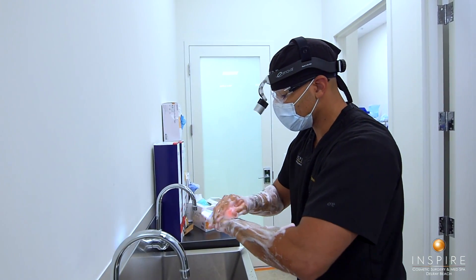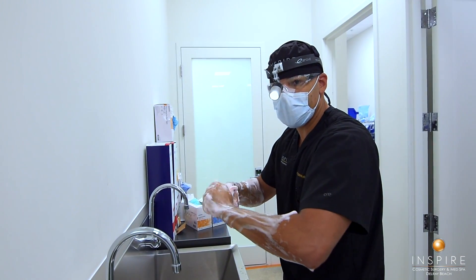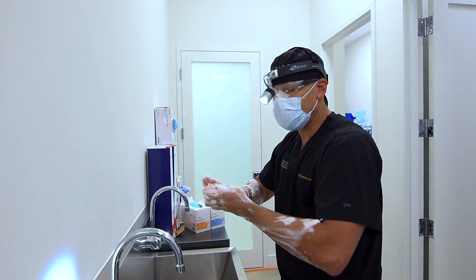So we're very careful in this surgery to protect the implant from getting contaminated from the nipple, so we protect the nipple with some nipple shields.